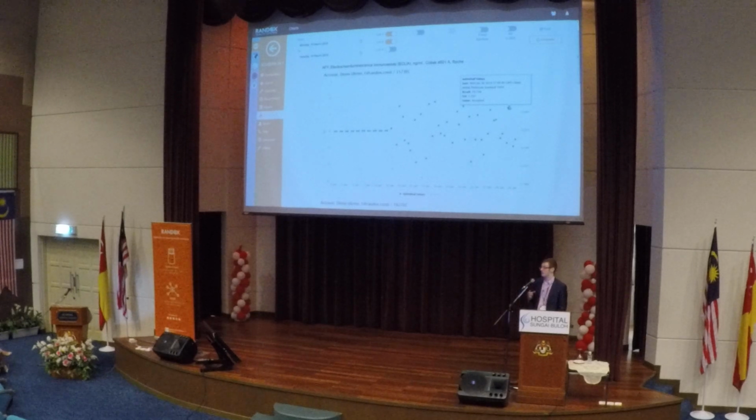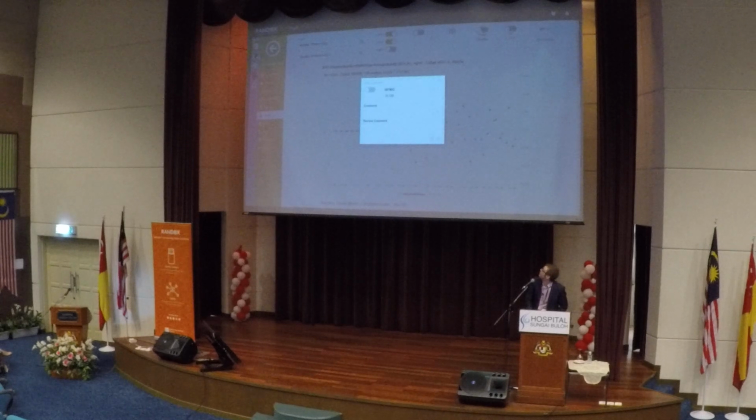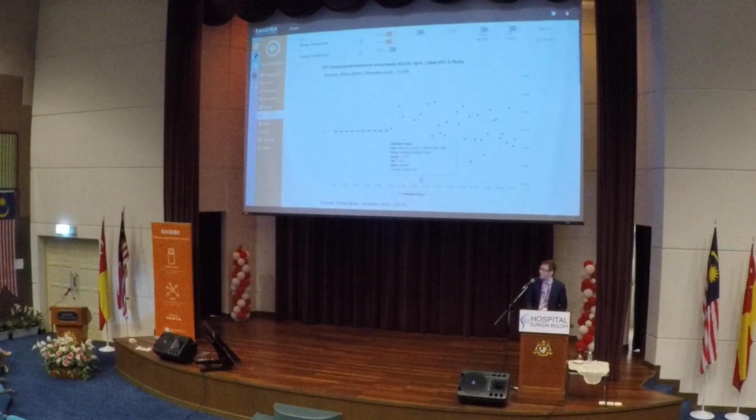And our software operates a very straightforward traffic light system. So we can see these points are all highlighted in green. So green means that they're fine, they have been accepted. We can then see some of our results are highlighted in orange down here. So those orange tests are alert. So an alerted test just means that it's something that we will want to keep an eye on. It's not necessarily a QC error, but it does mean that it's in that erroneous range. So it could be an error, or it could be nothing we need to worry about. So just something to keep an eye on.